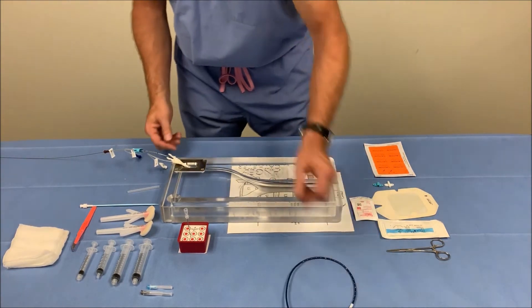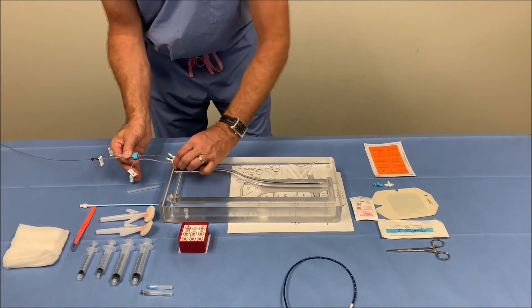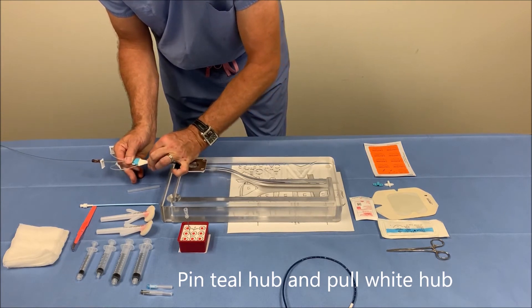I will demonstrate that in the model. Again, it's important to hold the teal portion steady and retract the white hub and lock it into the teal.